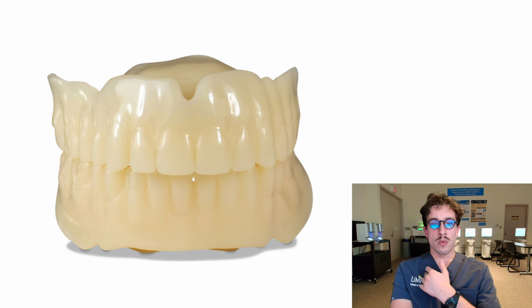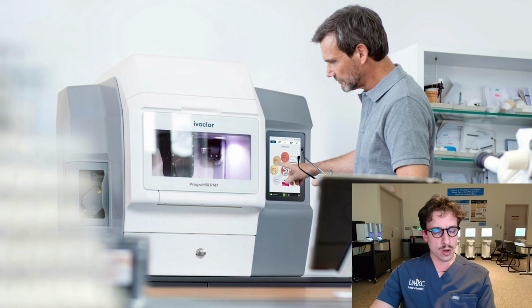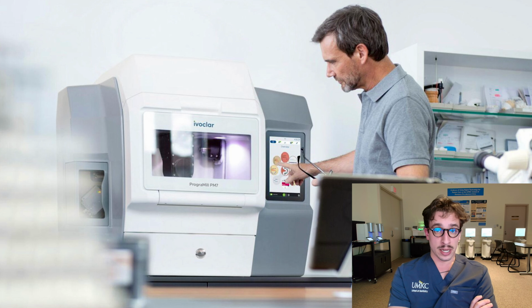And once we get to the point where we feel like what we are seeing in the mouth is very close to what we want the final one to look like, it doesn't have to be perfect. There can still be minor occlusal changes or angulation changes of the teeth. Once we get that back, then we can order our final prosthesis. And with our final milling process, there will be a video here on this playlist that goes through how we go about milling these in-house in our 3D lab upstairs. So we have a PM7 from Ivoclar, which is a top-of-the-line milling unit. This thing is absolutely amazing. And what we'll do then is we'll be able to mill it.